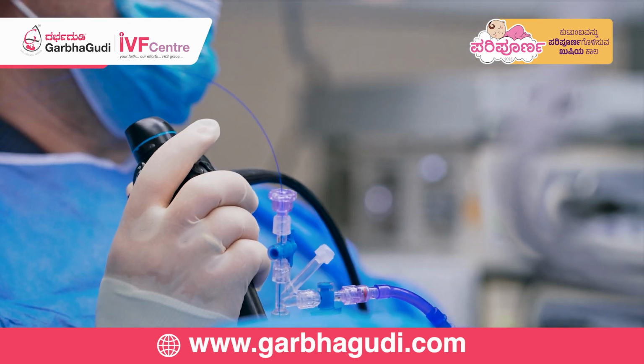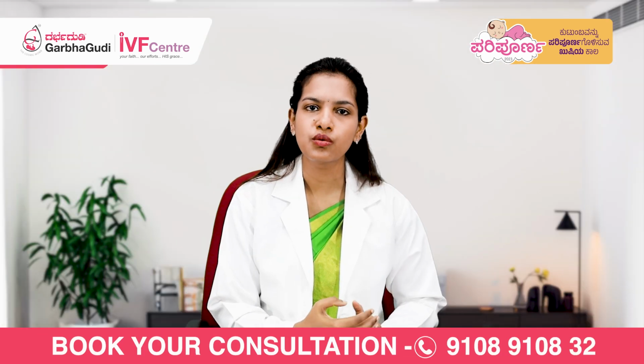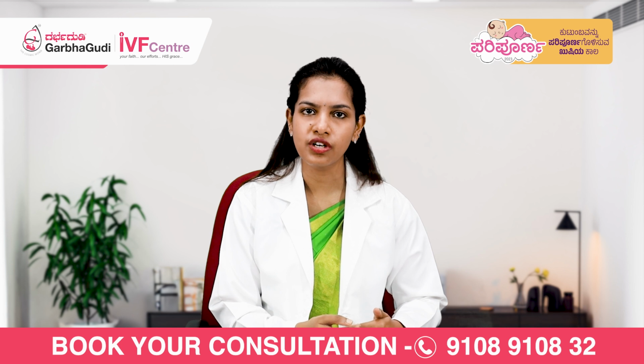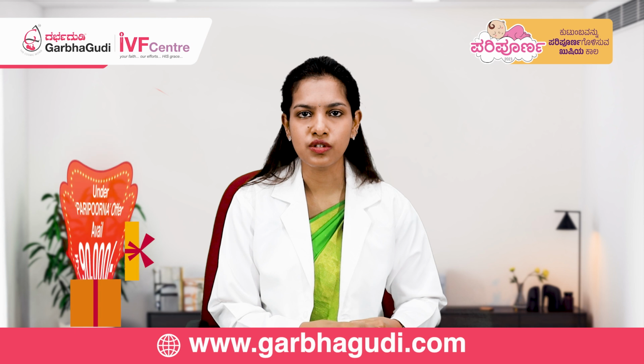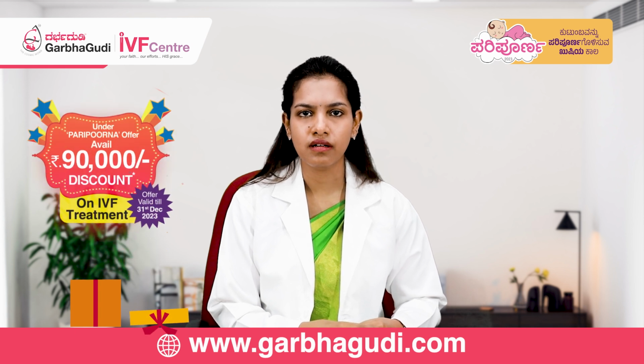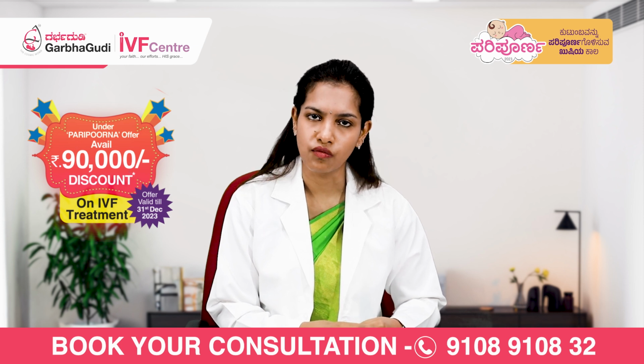Now coming to the procedure, it is a daycare procedure done under short anesthesia, which means that you can get admitted on the day of the procedure and get discharged a few hours after the procedure. It usually lasts about 15 to 30 minutes and might get prolonged by a few extra minutes in case there is an operative element involved.